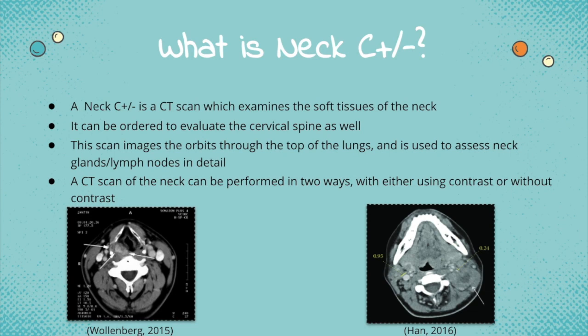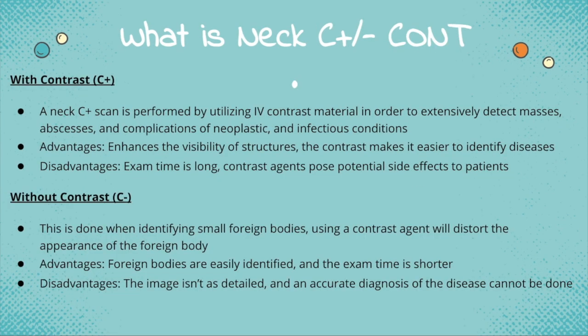nodes in detail. A CT scan of the neck can be performed in two ways, with either using contrast or without contrast. The image on the right is a CT scan of the neck using contrast, and the image on the left is a CT scan of the neck without the use of contrast. A neck C+ scan is performed by utilizing IV contrast material in order to extensively detect masses, abscesses, and complications of neoplastic and infectious conditions.